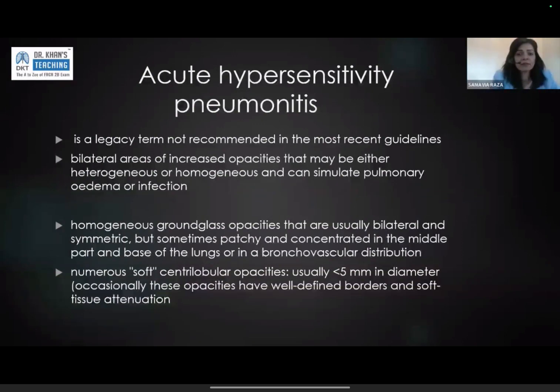If somebody presented with acute HP and had consolidations on their scan because of HP, the chances of them getting diagnosed with HP are very negligible, because the minute you have an unwell patient presenting to you and you have a consolidation, you are going to call it infection. If nothing, you may put in a differential of organizing pneumonia or metastatic disease or something like that. HP is usually pretty low down on a differential for somebody reporting an acutely unwell patient with raised inflammatory markers and consolidation on a CT scan.